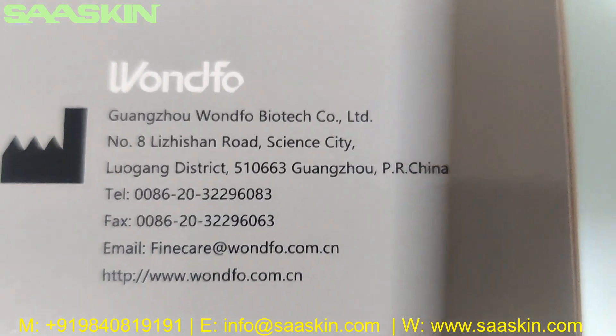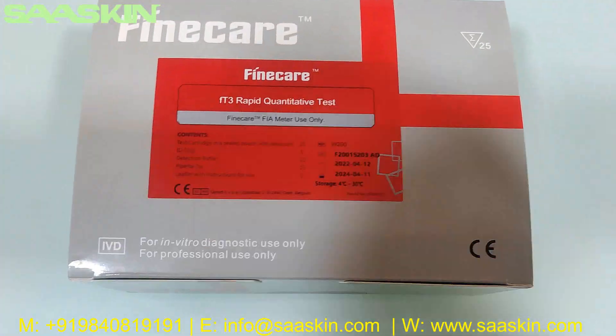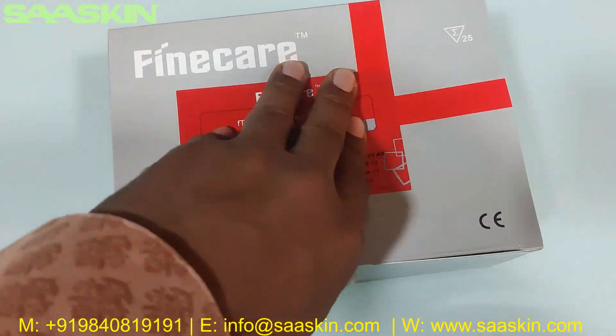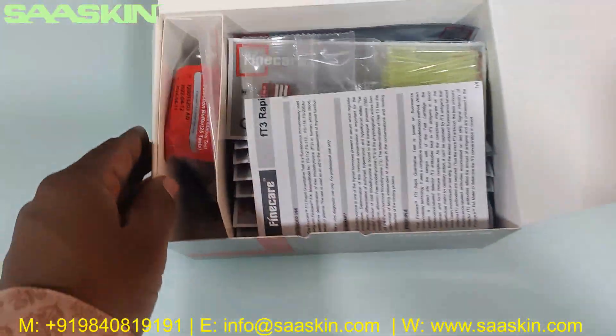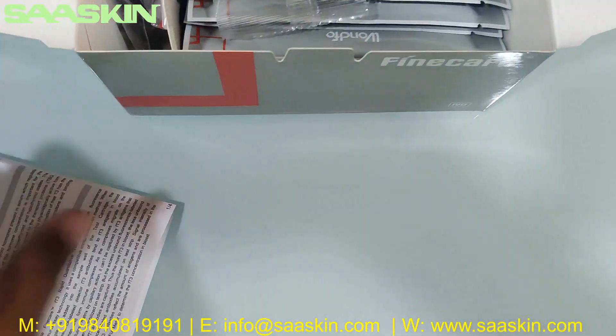You can see this is manufactured in China. OK, I'm going to unbox this for you. Inside you can see there is an instruction manual.